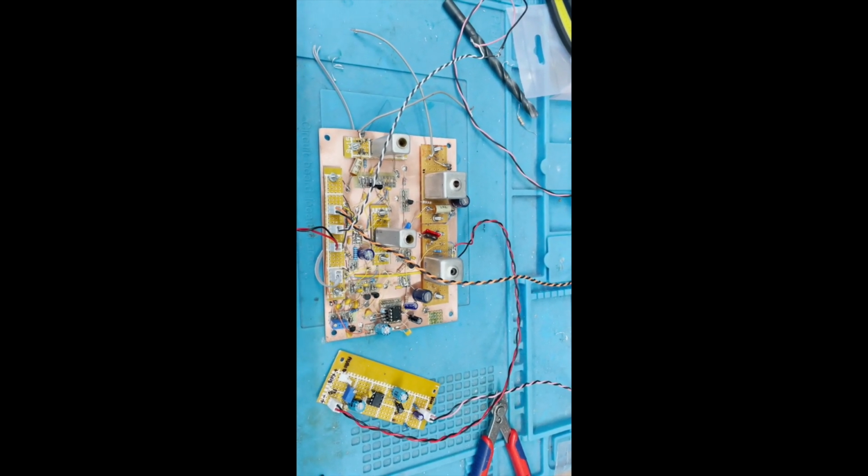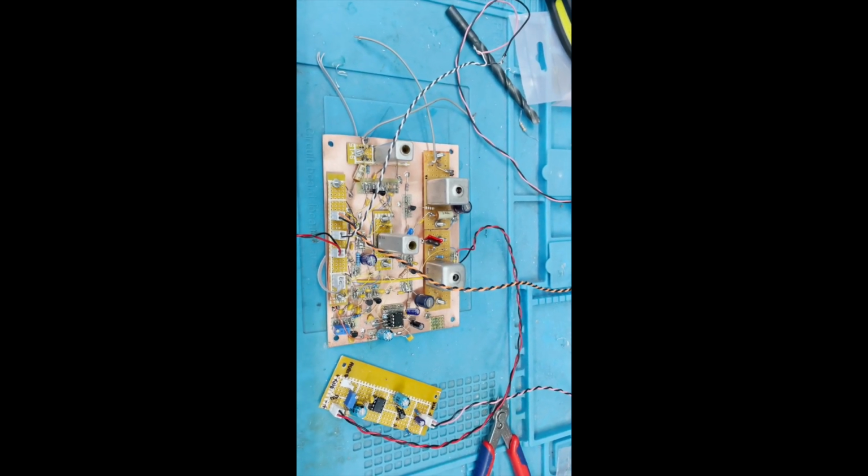Moving on, this little board here is merely the board for the VU meter, which is quite a useful touch. Not essential by any means, but I thought it would be quite a nice touch. And that's about it really. So I'm going to mount these inside the box and do a bit of painting, do up the panel, so hopefully we should have the finished article.